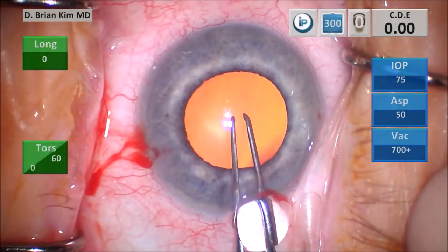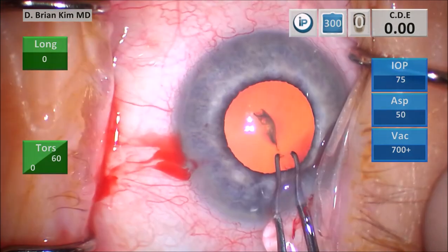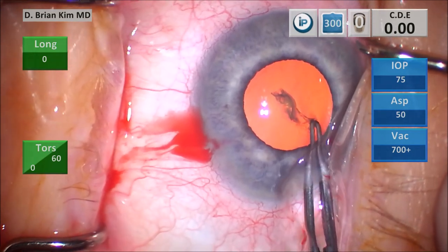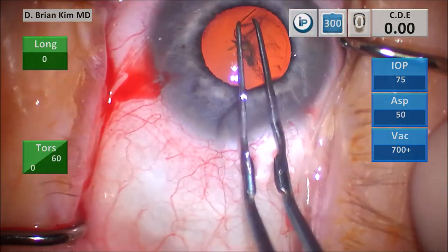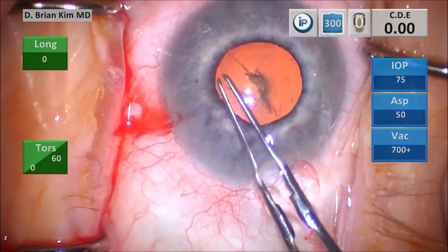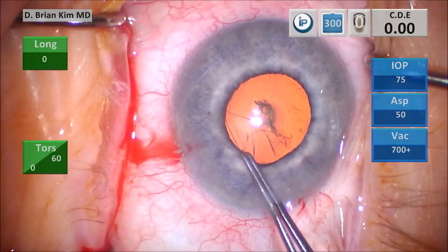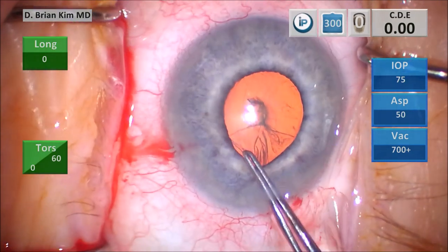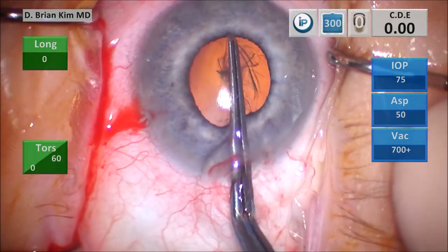I'm doing a puncture-style capsulorhexis. I puncture the center and then pull down, trying to pull a little bit to the right to create a flap. As I create that flap, I'm able to go around circumferentially following the corneal marks, which help me center and size my rhexis. As I begin to go around circumferentially, I notice the iris begins to come down. You can tell this means the pupil was large primarily because of the viscodilation — not because it was stable itself — because as the viscoelastic comes out during the rhexis, the pupil became smaller.